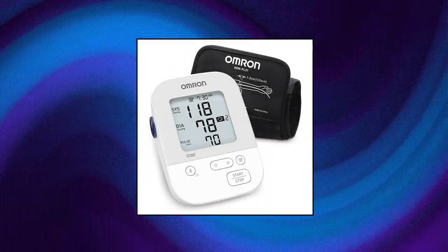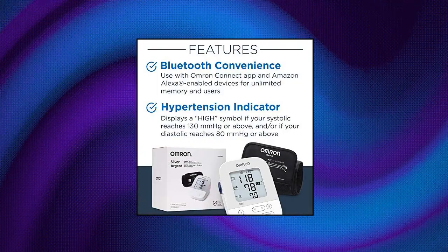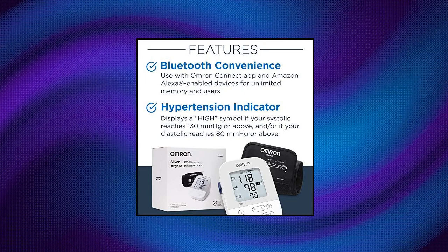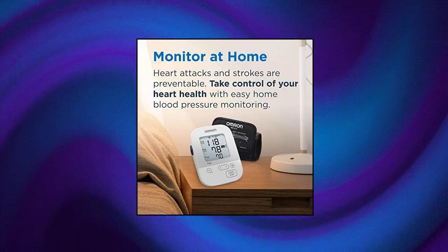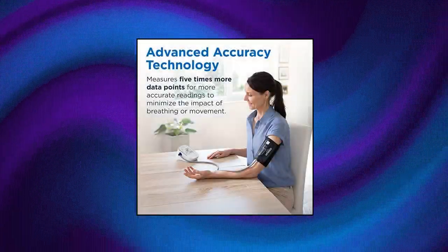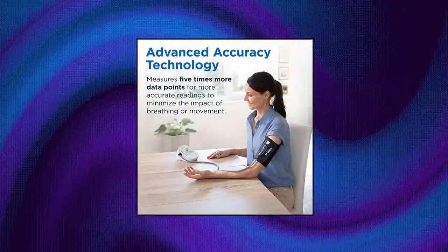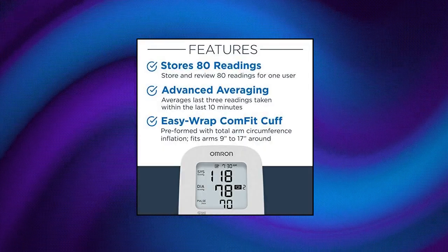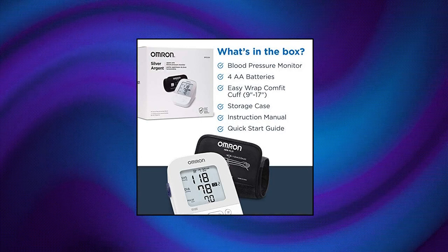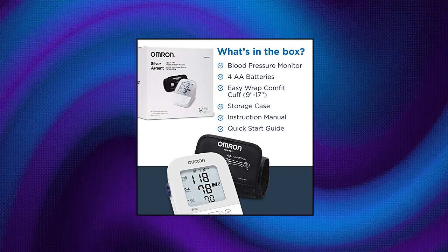Omron Silver Blood Pressure Monitor, upper arm cuff, digital Bluetooth blood pressure machine. The Omron Silver upper arm monitor provides unlimited memory and stores 80 total blood pressure readings for one user. It also works with the Omron Connect free app, which is compatible with Amazon Alexa-enabled devices. Number one doctor and pharmacist recommended brand of blood pressure monitors. With advanced accuracy and exclusive Omron technology, this monitor measures 5 times more data points for consistent, precise readings.